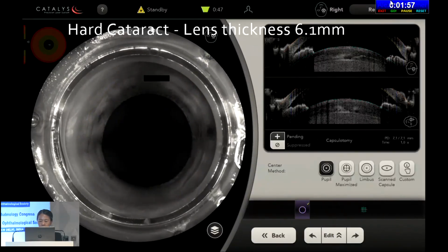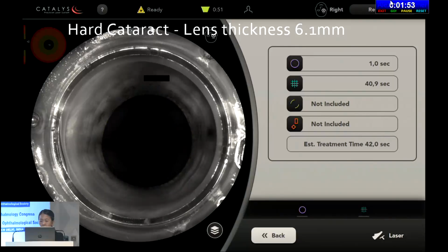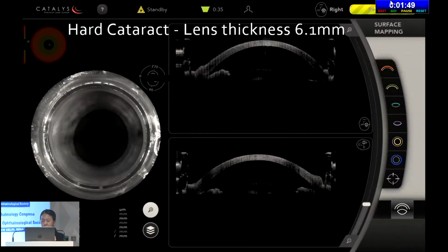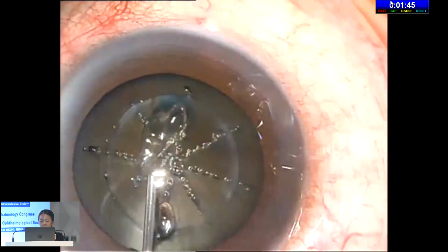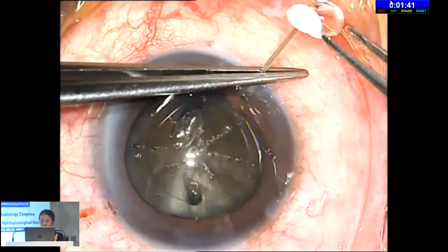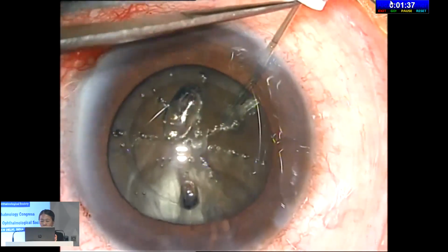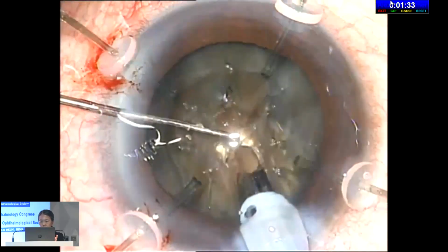But what is very important is always the plane in which you do phaco and topping up dispersive viscoelastic to preserve the endothelium. So again here you can make a larger capsulotomy, or you can just do a standard one. I generally still prefer a 5 mm. And you can see here after the femtocapsulotomy and segmentation, I don't like to really do too much of a gridding of the nucleus because I find that it's too much distension of the capsular bag with the gas that's produced during the femto treatment.